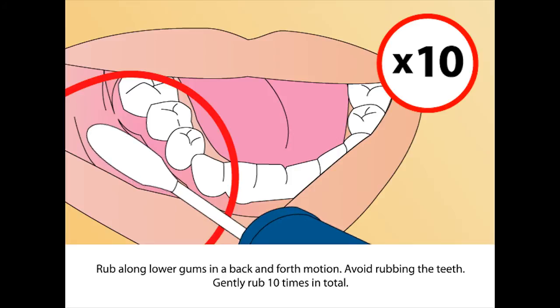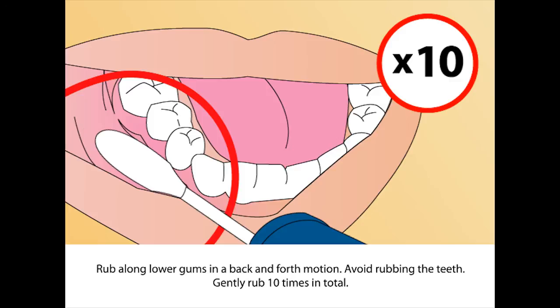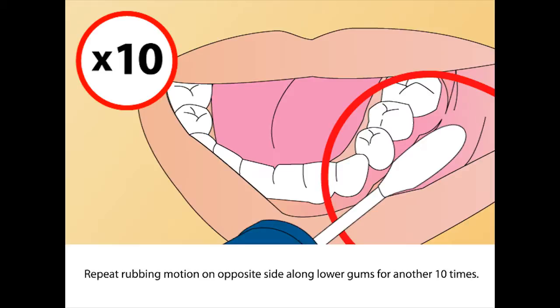Rub along the lower gums in a back and forth motion. Gently rub 10 times in total. Repeat the rubbing motion on the opposite side along the lower gums for another 10 times.